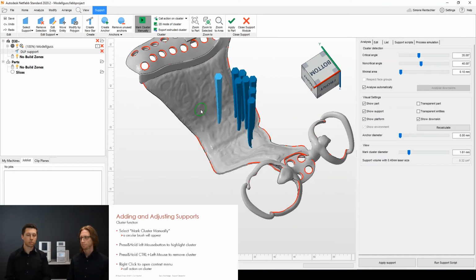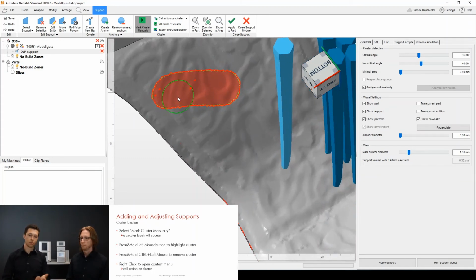So, but in order just to see what's going on, if I now want to mark some area, some cluster, I will have to press and hold the left mouse button to highlight it. So I just highlight this area, and you can see now this area is my cluster which I defined. Of course, it might be needed that I delete some areas again. Also use Control again. So Control is a mighty button here. Control, press and hold it, and just use the left mouse button again to erase it. So now I'm erasing it, calculating new clusters. So this is how I can manipulate manually the cluster areas.